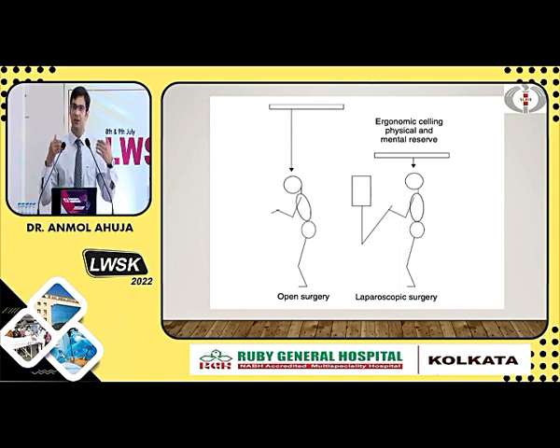But in laparoscopy, though we are standing straight, the continuous feedback from the monitor and the hand-eye coordination, as well as the adaptation of the brain to see a 2D image and process it as 3D, lead to mental fatigue as well as physical fatigue.